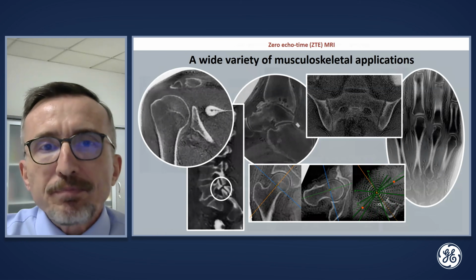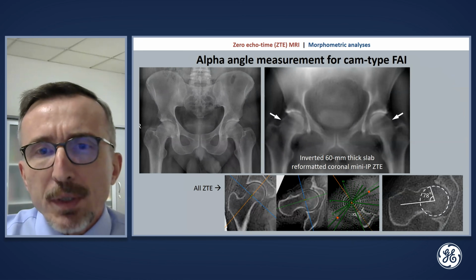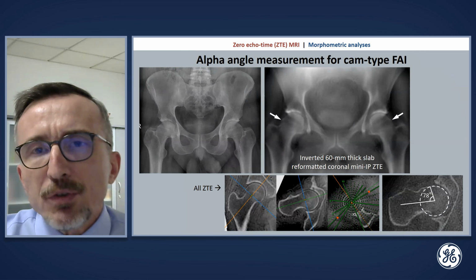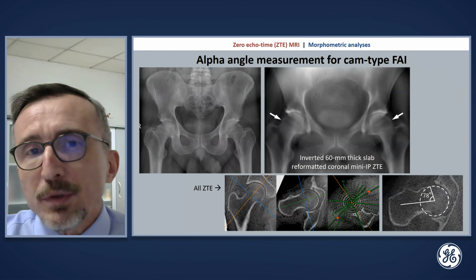We have a lot of musculoskeletal patients within a very wide spectrum, ranging from traumatic to degenerative to inflammatory, oncologic, and we started to use ZTE almost on a daily basis. We incorporated it into most of our protocols for the last year.